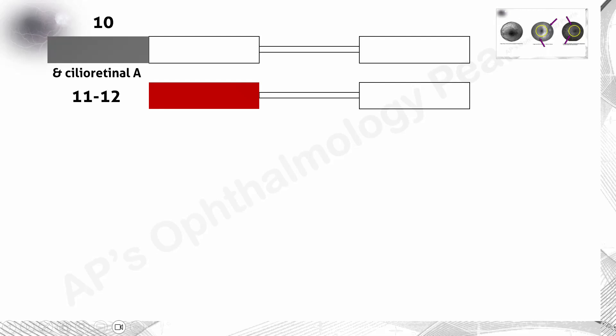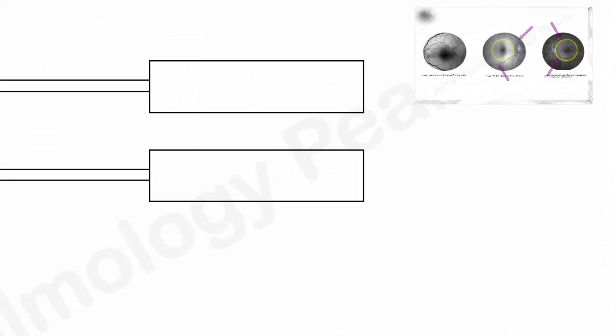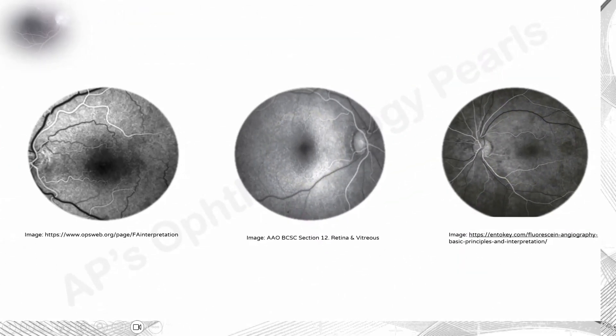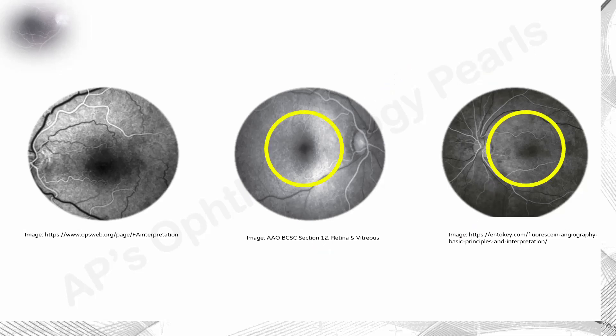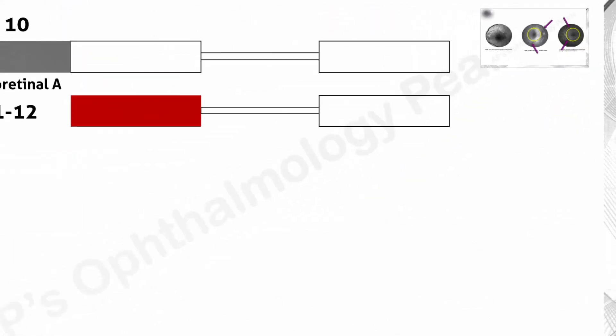The arterial phase of the fluorescent angiogram starts about 1 to 2 seconds after the choroidal flush. This phase starts with the entry of fluorescent dye into the central retinal artery, marking the arm-to-retina circulation time, which is an average of 12 seconds. The veins appear black, and the foveal avascular zone appears darker because of the absence of vessels and the presence of the retinal pigment epithelium, which blocks choroidal fluorescence.